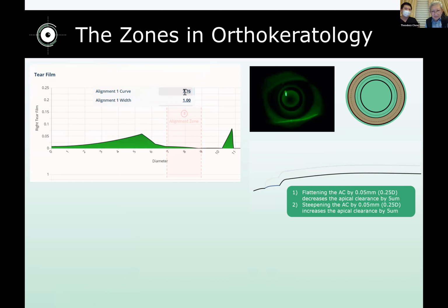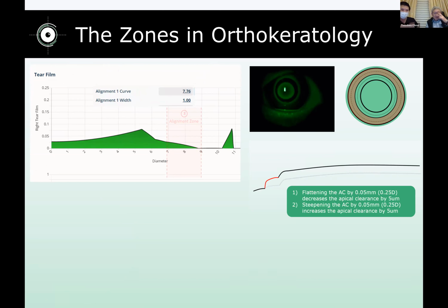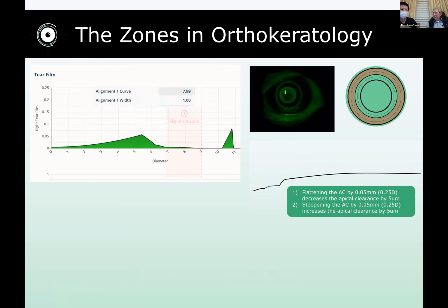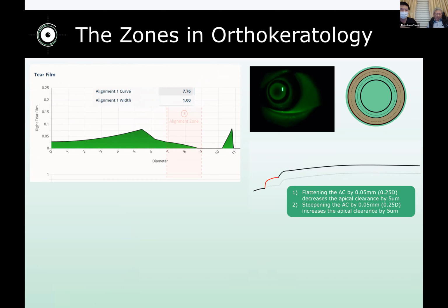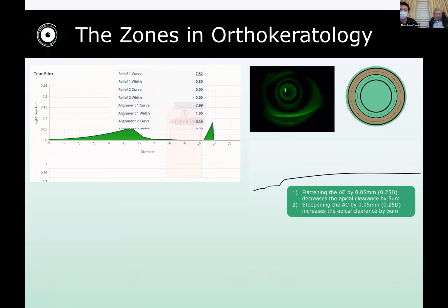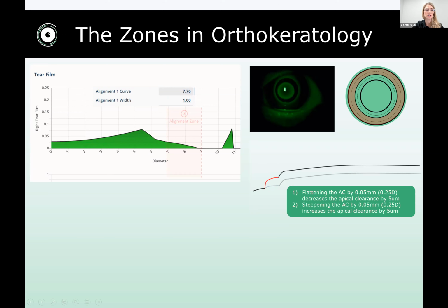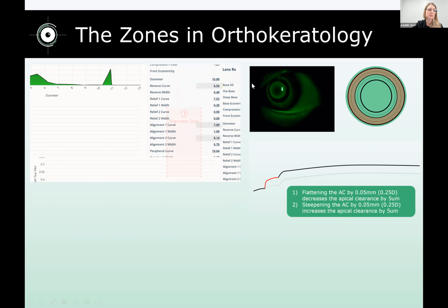If you can see in the lens designs, I don't know if that was the question, I'm sorry if it's not, but a 0.1 millimeter difference in those trial lens sets will be roughly a 10 micron sag difference. I'm not sure, it's not my question, but I do think that answers the question, the relationship there. Here's another question.